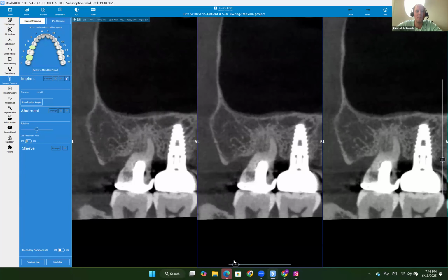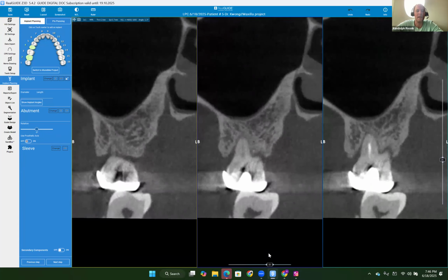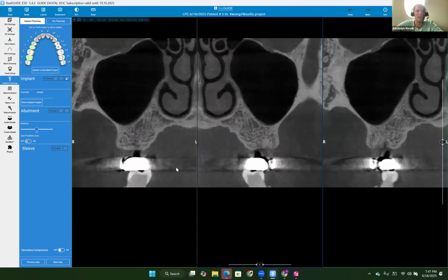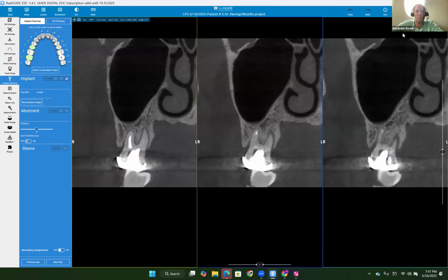In terms of doing an immediate implant at number 2, I would highly advise against that. That's going to be a very challenging immediate implant. Taking it out and grafting it, if I recall, she's going to have about 8 millimeters of bone right now, right? Yes, sir. Approximately.